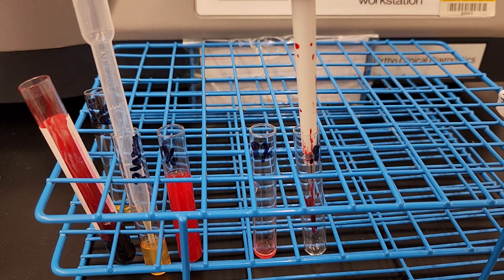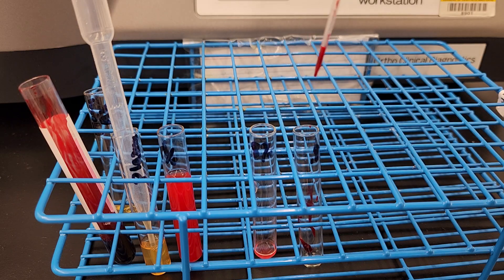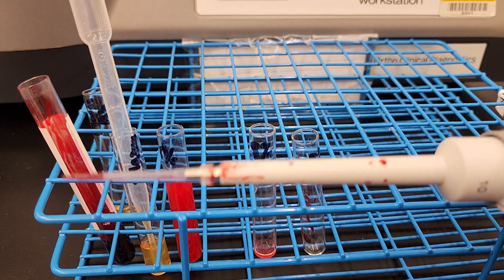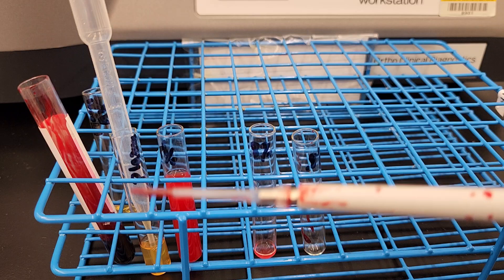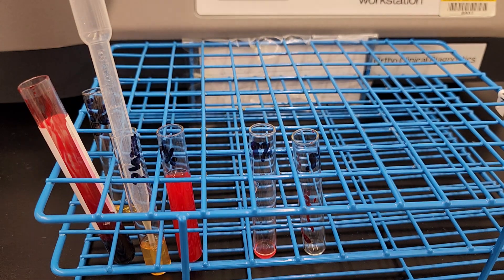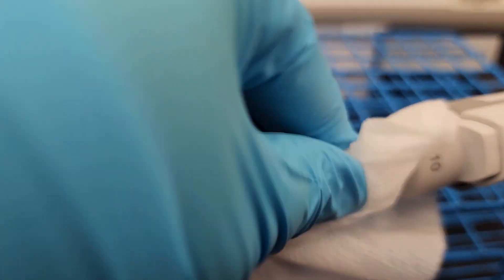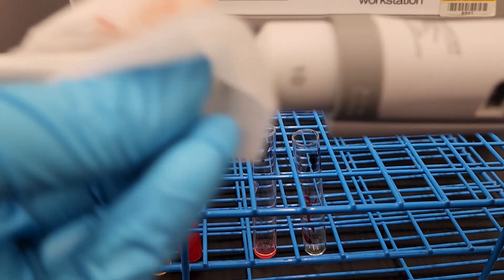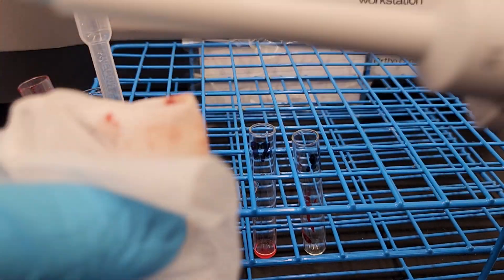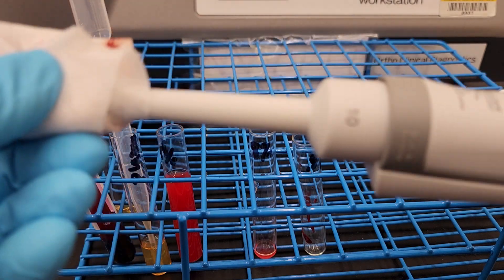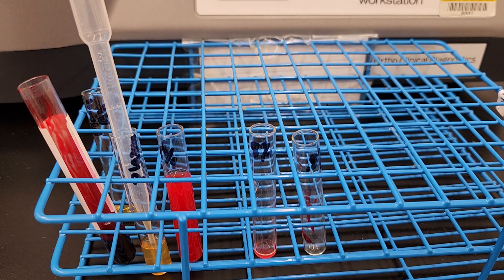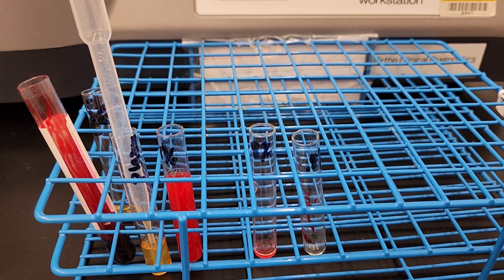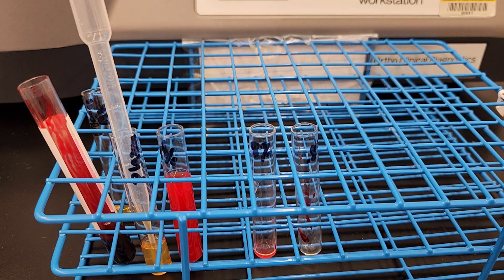Notice, though, that you do have a very nasty-looking pipette after going immediately in there, and that's because of it bumping up against all of the inside of the tube. So I'm going to clean my pipette. So my preference, honestly, is to do this from the red cell suspension because it's less dirtying of your equipment. The analyzers in a clinical laboratory, the fully automated ones would end up having a probe that does this for you. Okay, so that is that right there.